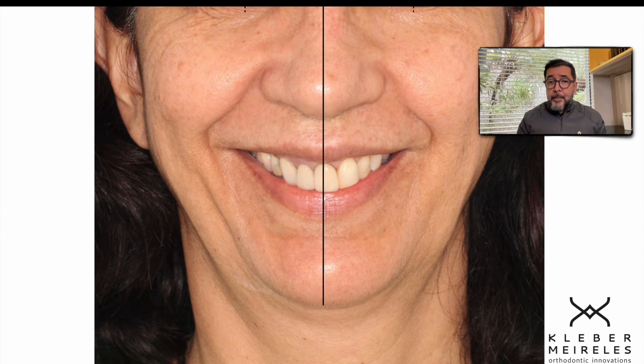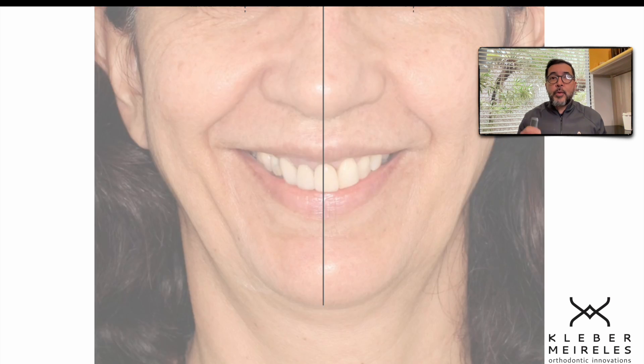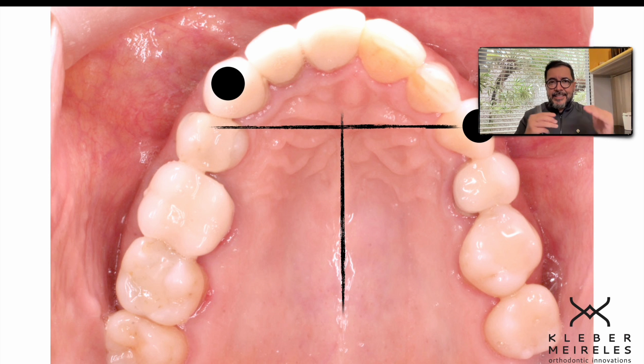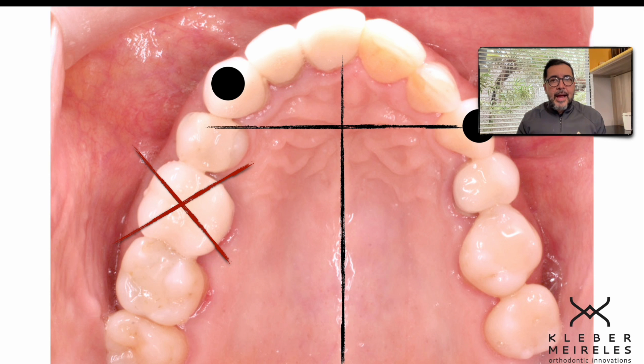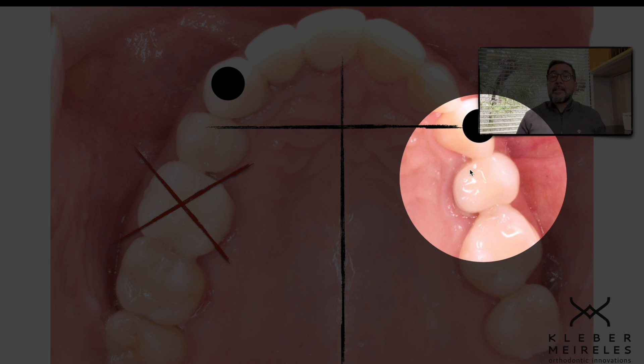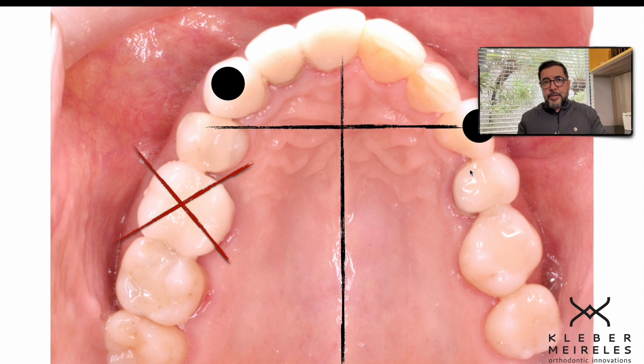In this case, for correcting the upper shifted midline, I did the extraction of one molar. Let me show you how I deal with this type of treatment when I need to do the extraction and close the space with loops. She had this asymmetric positioning of upper canines because of asymmetric extraction in her previous treatment. And because of the extraction of the first molar on this side, the midline shifted towards that side.